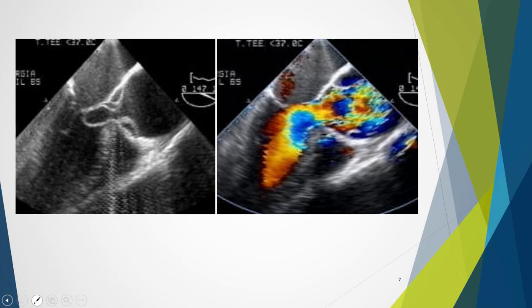Here we can see a dissection that has come down and the support has been lost to the aortic valve — it prolapses into the ventricle. When colour is applied, we can see a significant amount of regurgitation with a lot of flow going back down into the ventricle.